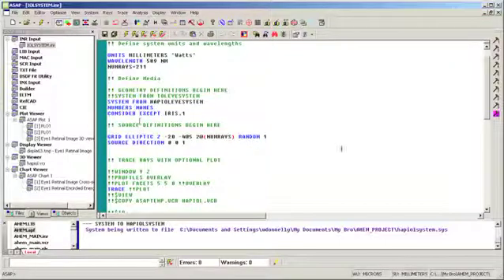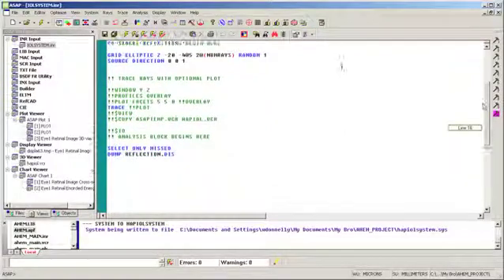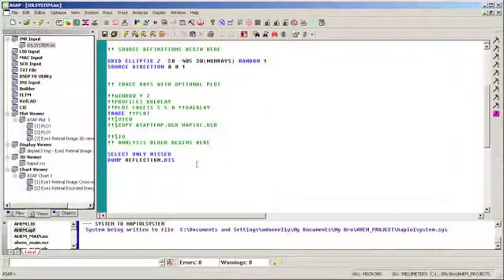I do a numbers name command to find out what my iris is called, and that's what it is, iris.1. So I consider everything in my system except that iris. I create a source, and I trace that through the system, and I select the rays that leave the eye or that are leaving the cornea, and I dump that to a reflection distribution file.